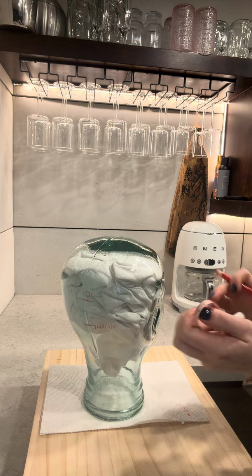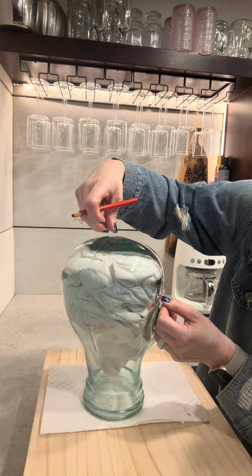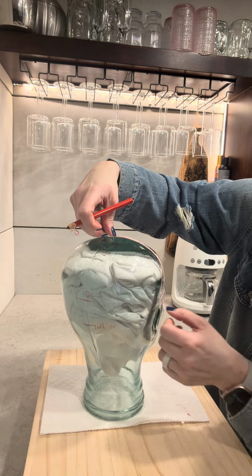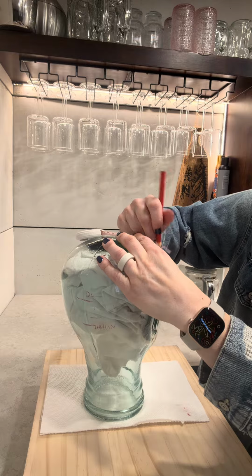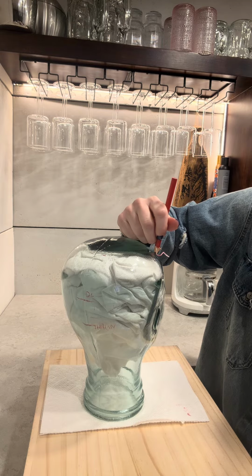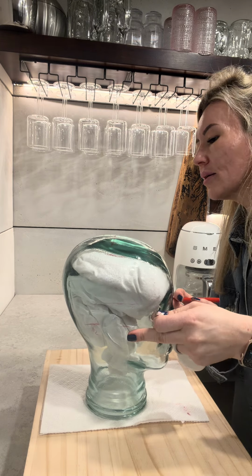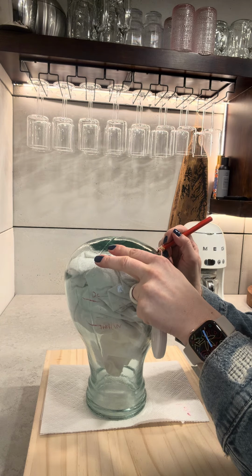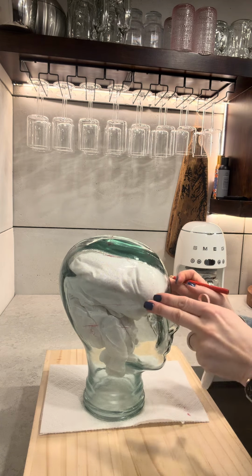And on the opposite side, from T4 to Cz, okay, and that is my C4. Okay.